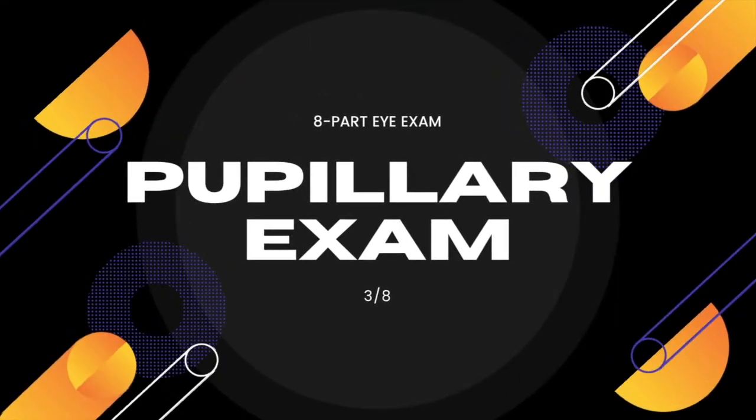The third exam is the pupillary exam. We turn off the light to decrease the room illumination. We then ask the patient to stare at a distant target. Shine a bright handheld light directly into the right eye by approaching it from the side. We then record the direct pupillary response to light in the right eye in terms of briskness of response.